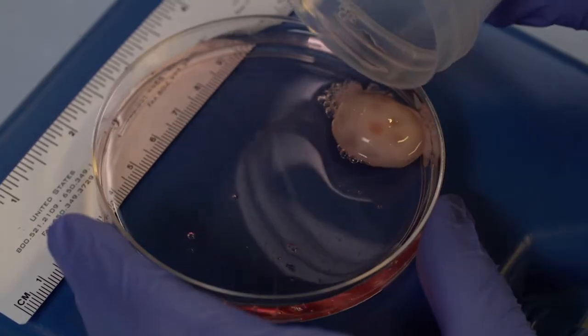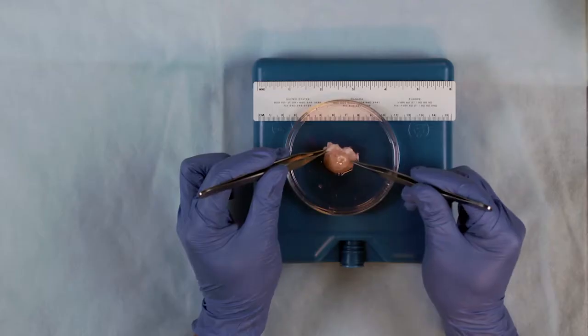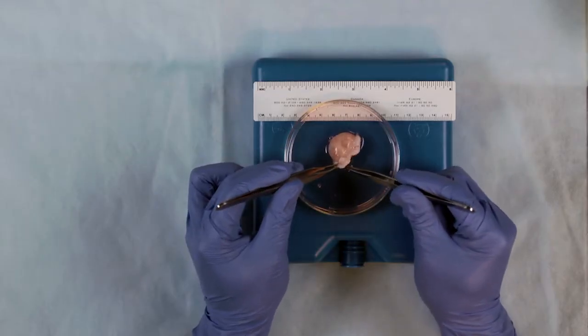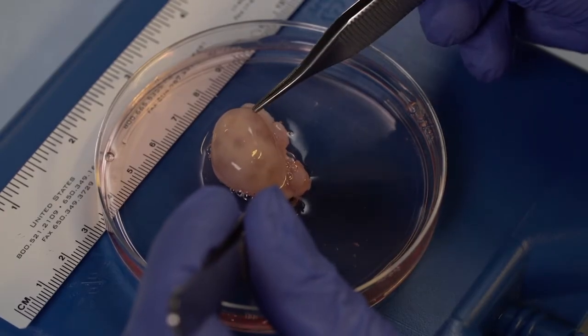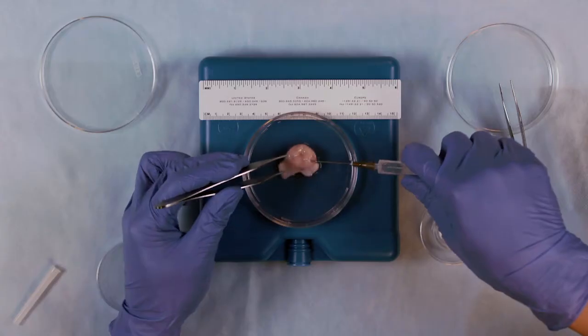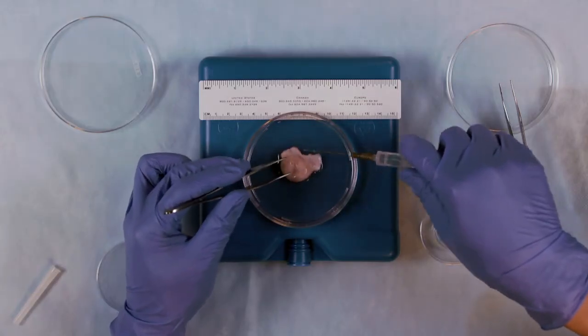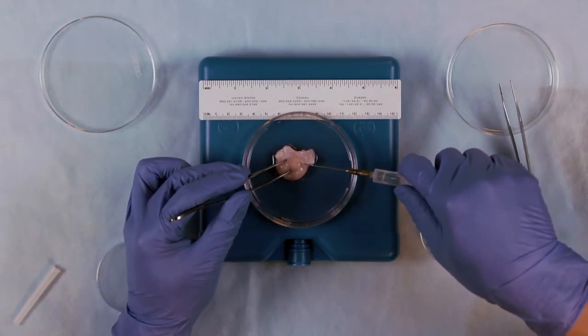Tip the ovary out into a 100-millimeter petri dish. Examine the ovaries to check if there are any antral follicles on the surface. Aspirate those follicles using a 3cc syringe with an 18-gauge needle.